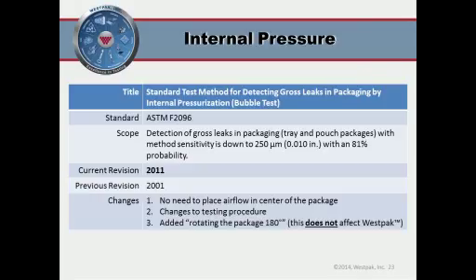So I want to emphasize that it takes a fair amount of expertise to discern a true leak, what we call a channel leak, from the normal breathing patterns. So basically, you expect the product to leak. You just don't expect it to leak a lot in one particular place. So it takes a fair amount of expertise and experience to determine the difference between those two on a regular basis. And this rotation that Katie mentioned is something that we've been doing for a long time because it simply helps us identify what is in fact a true leak.